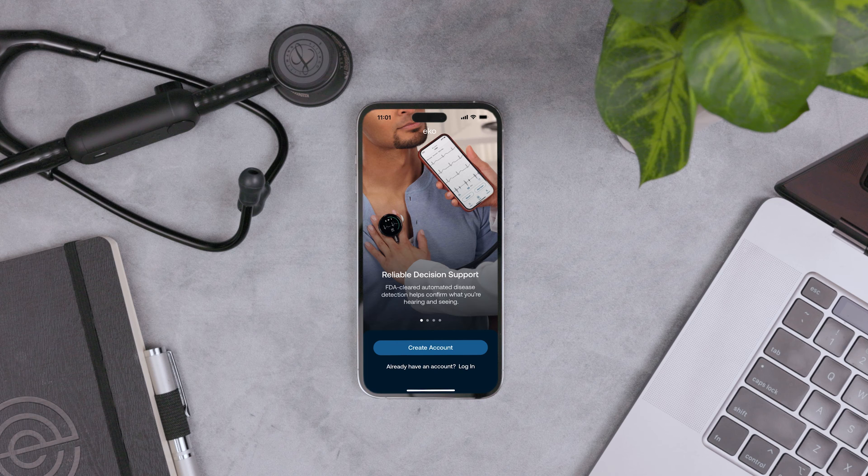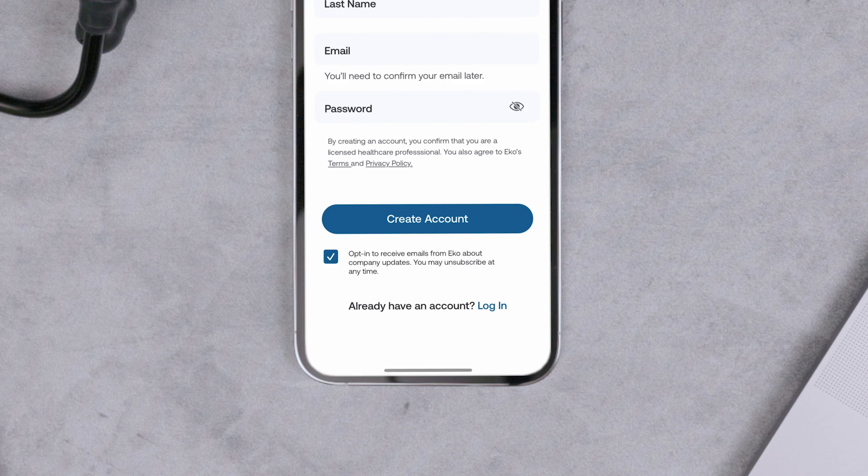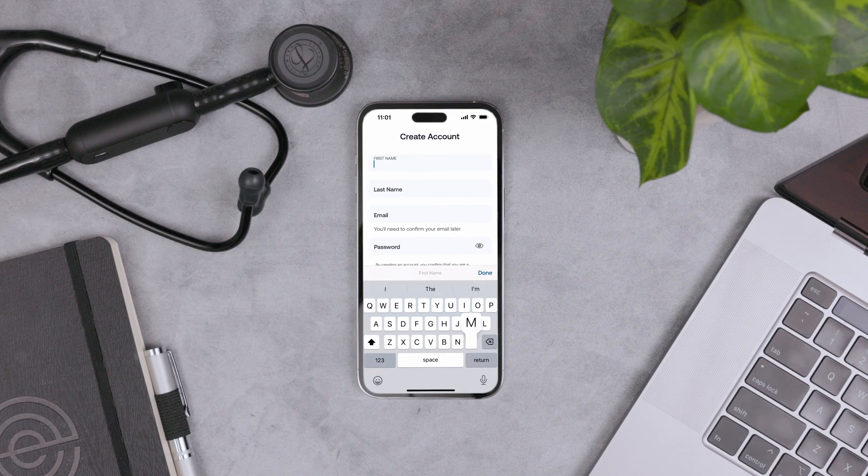Next, create an Eko account in the app. At the bottom of the screen, tap Create Account. Enter your information and look for a confirmation email in your inbox — you'll need to confirm your account.